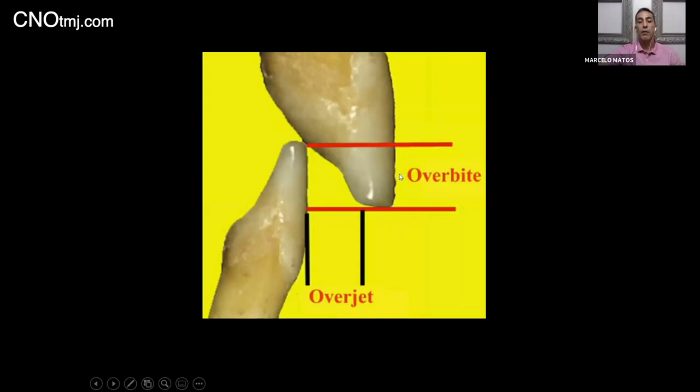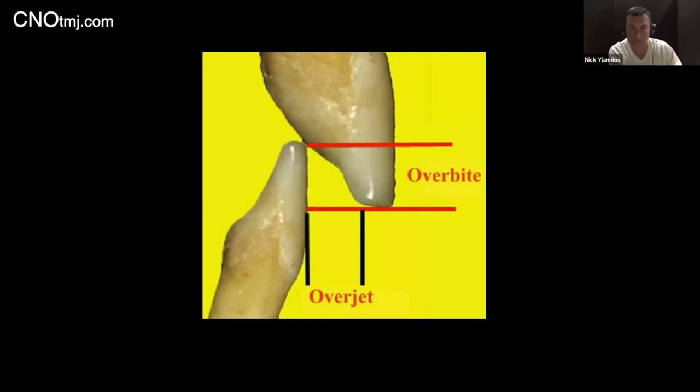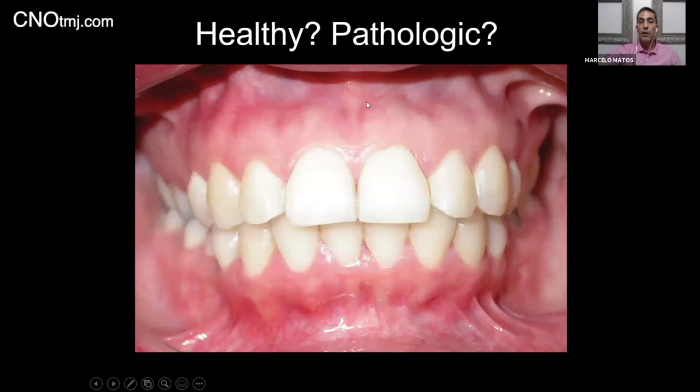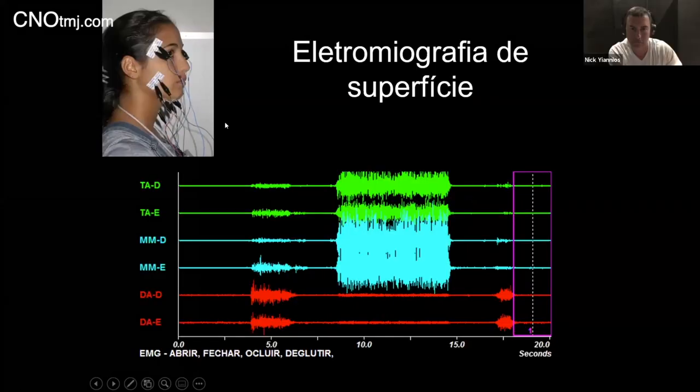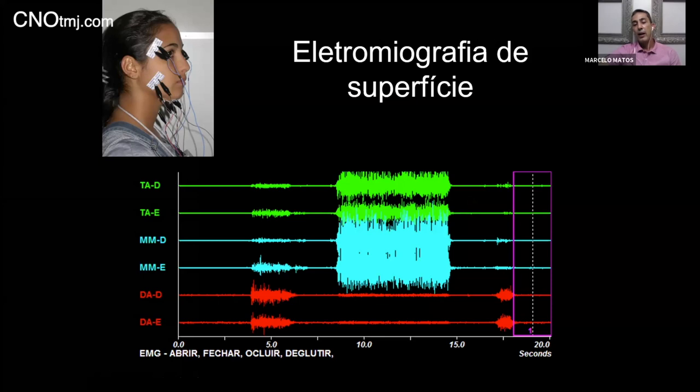We see the relation and we say, okay, there's an overbite or there's an open bite. But okay, this is a visual analysis. And how about measuring? I'm not talking about how many millimeters the person has here, but in terms of function, to have a glimpse about the healthy or pathologic status. This is where the EMG jumps in. You have to use the EMG to do that, because in the same way as I was talking about the knee joint, you may put it in an uncomfortable position, and sooner or later you're going to have to change the position to get a more comfortable one, and you're going to use the muscle to do that in response to neurological inputs. So once we have the EMG over the muscle, we can understand a little bit of what is going on.